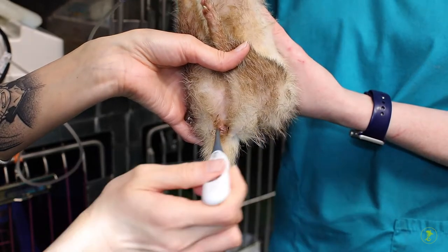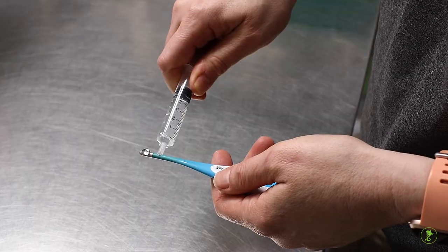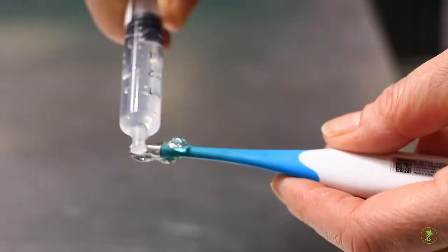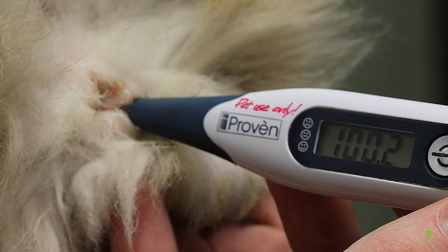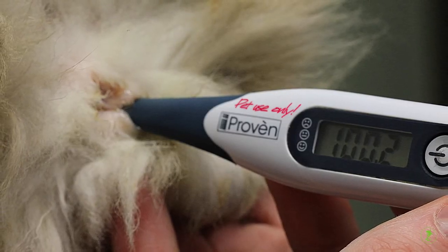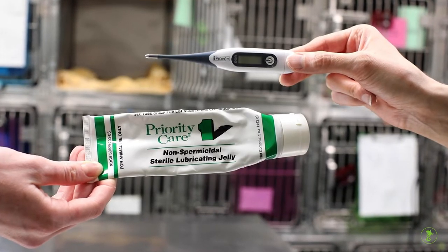It is important to restrain your pet carefully to prevent injury. Use a thermometer with a soft flexible rubber tip. Label the thermometer for pet use only so it doesn't get mixed up with thermometers used for people. Use some lubricant like petroleum jelly.